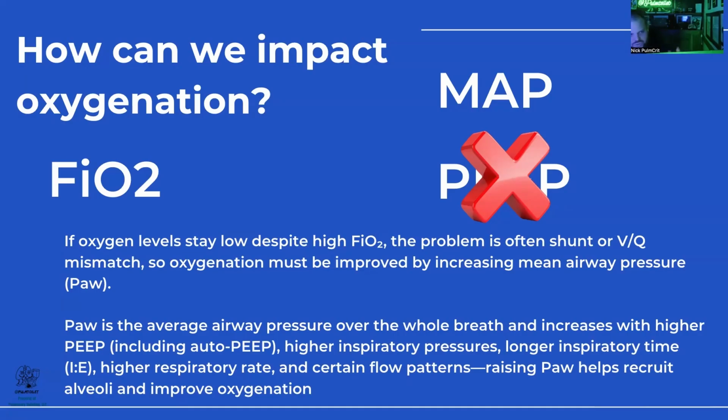Not that I would do that, but if you were in pressure control and you were satting 80% or something, and instead of going from 5 to 20, so 15 of inspiratory pressure, you made that 30 of inspiratory pressure, that's definitely going to increase your mean airway pressure. We did this before, but what mode do you really crank up the mean airway pressure by going up on the airway? That's APRV. Exactly. Yeah, so Brendan's got it.